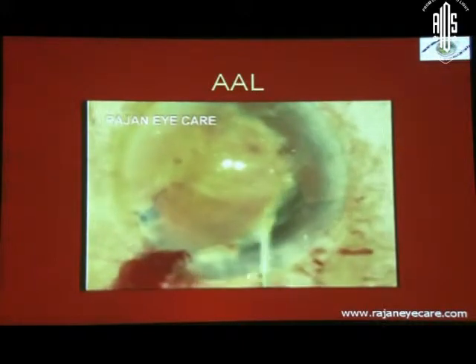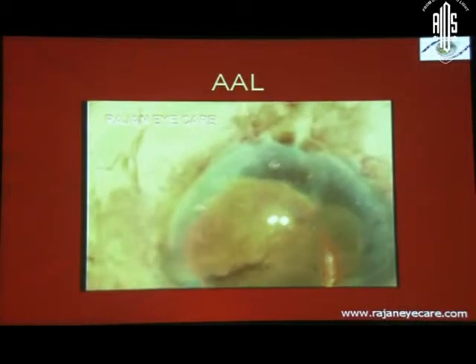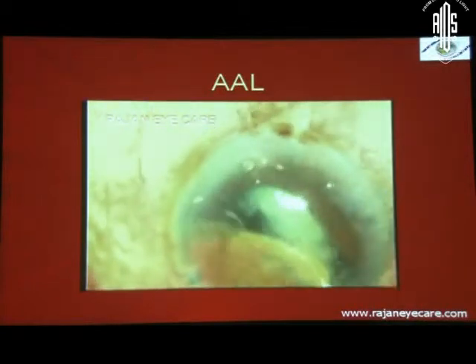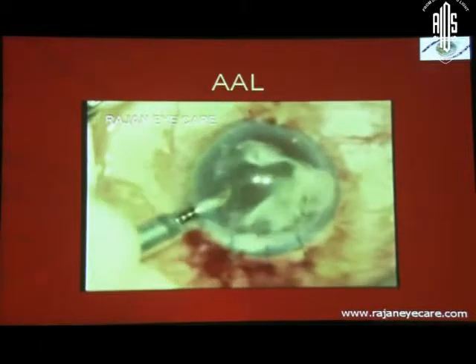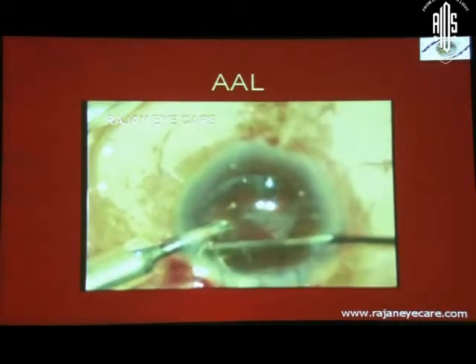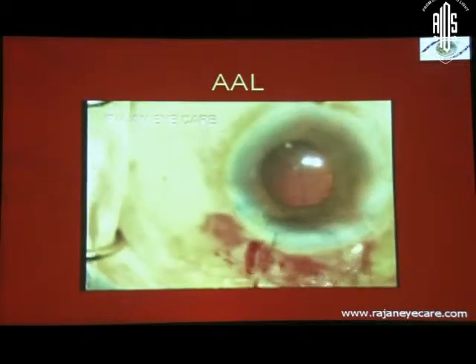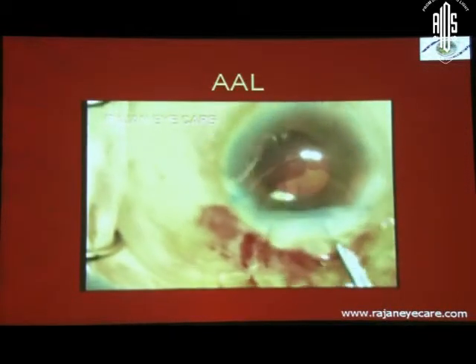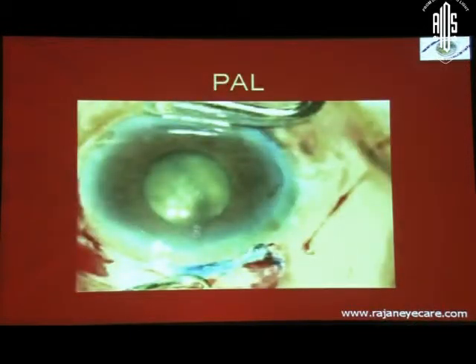But what is more important, as soon as I chopped, the lens started sinking. But I could see the lens nucleus. You can see how huge the nucleus is. So the lens nucleus is in the anterior vitreous, in the pupillary area. This is called anterior assisted levitation, wherein you put in a rod and bring it up from the anterior vitreous into the anterior chamber, and then you deliver it. In this case, I did an anterior vitrectomy and put an anterior chamber IOL, and the patient is doing well.